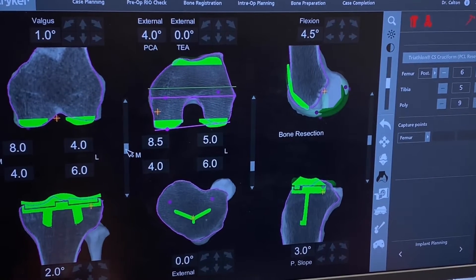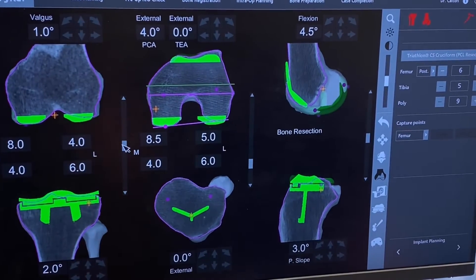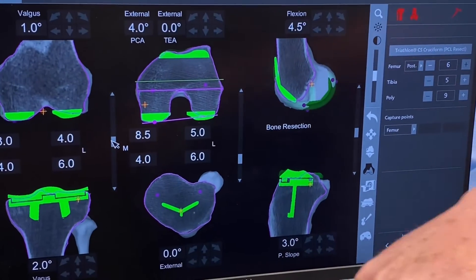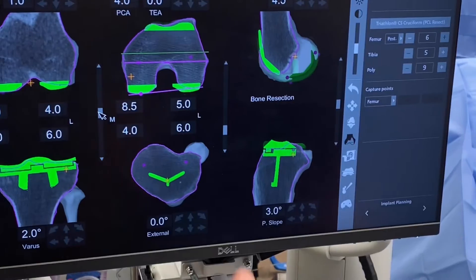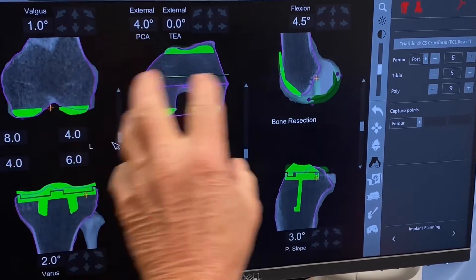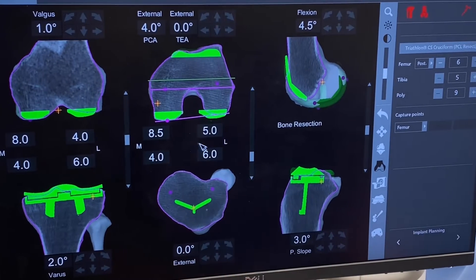So we're going to start off with a couple of degrees of varus and offset that with one degree of valgus. But the real secret is when we register the knee — we get inside the knee and make adjustments so that his knee is completely stable in extension, and we do the same in flexion. Those have to match up. That's the art of putting a balanced knee in place, and the robotics is a really cool tool to help us do that.